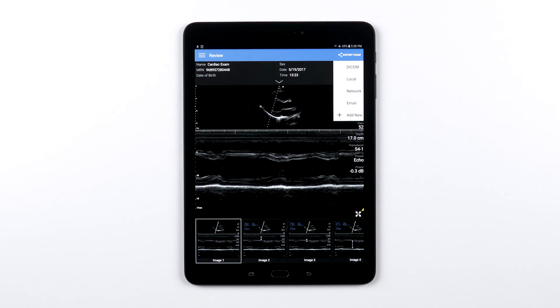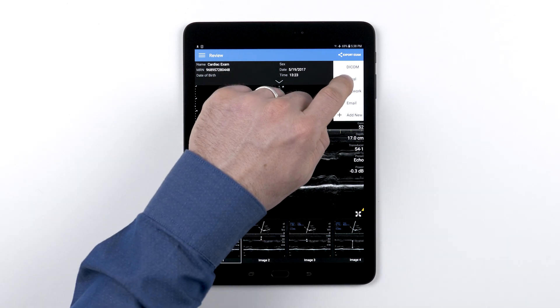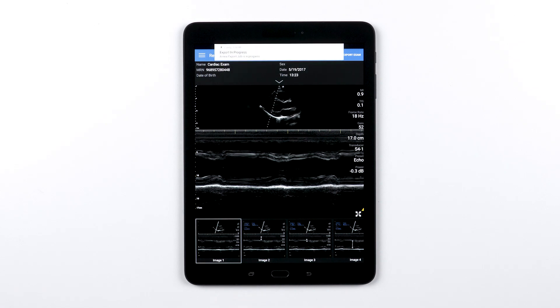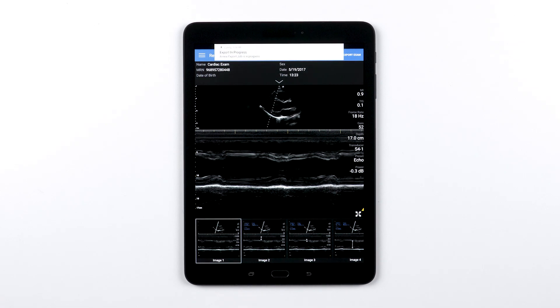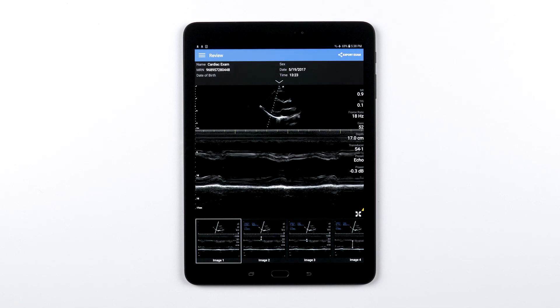In this case we'll choose the local media destination we already set up. As soon as you tap that export destination, the selected exam, exams, or images will begin to export to that location.